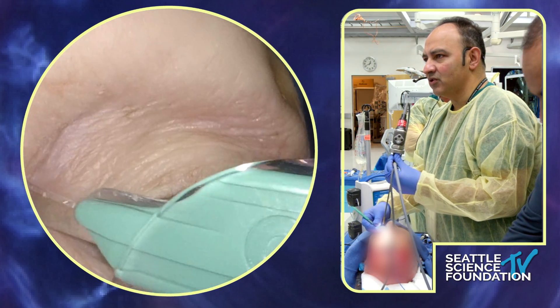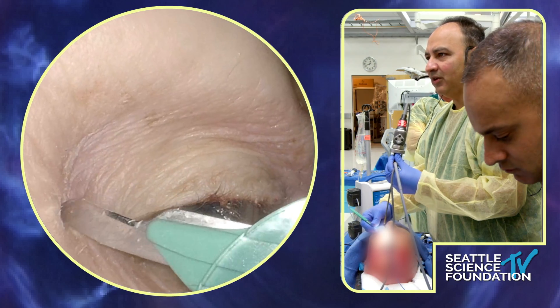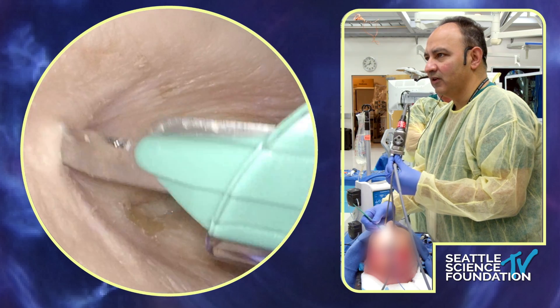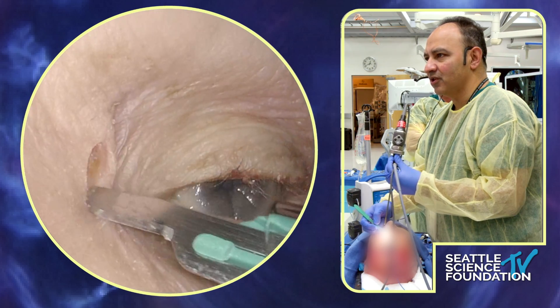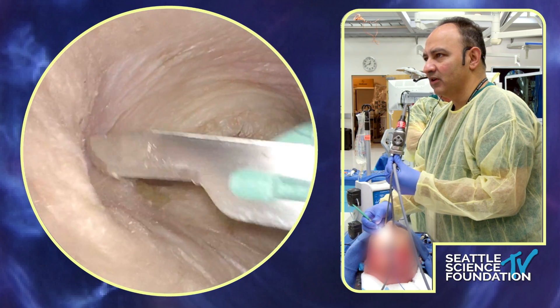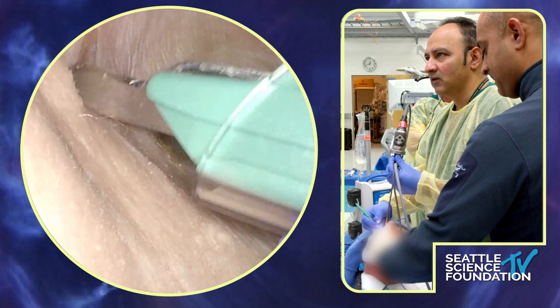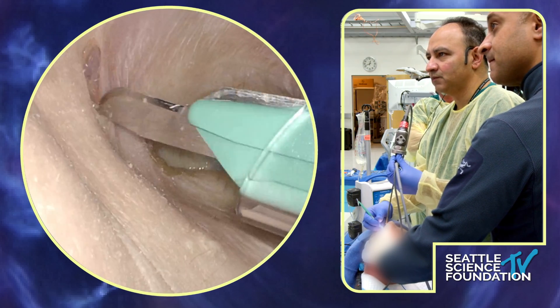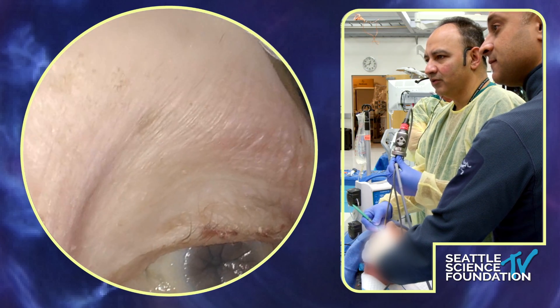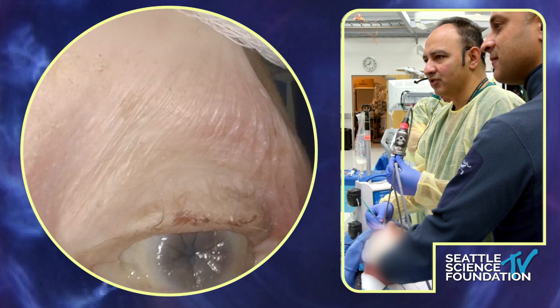Let's use this knife to work our way down through where I made that thumbprint. Sure enough, I'm able to do that. He's an older specimen so I'm going to be generous with my incision here, just so we can move along at a good pace. I'll take the scissors in a second. In real life, I'd be a bit more careful right now, but that gives us a good view. There's going to be some fat in that location.